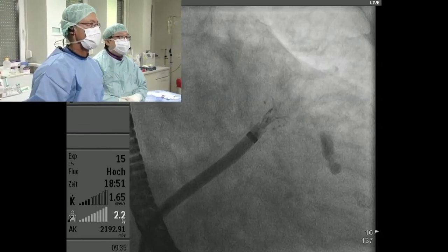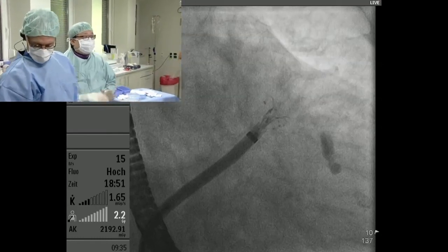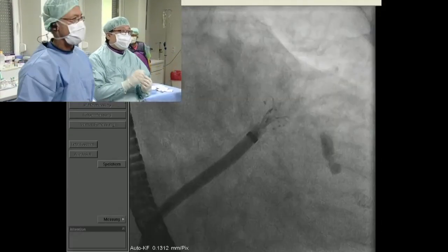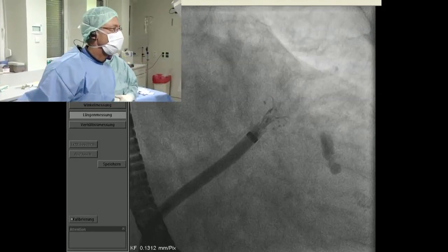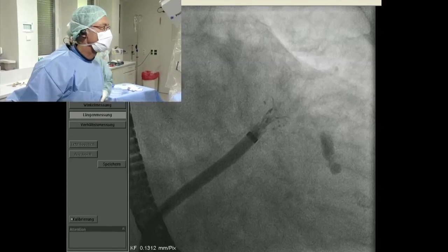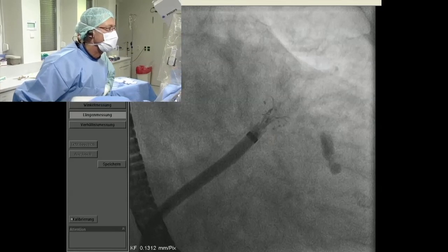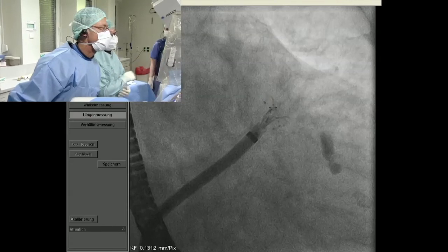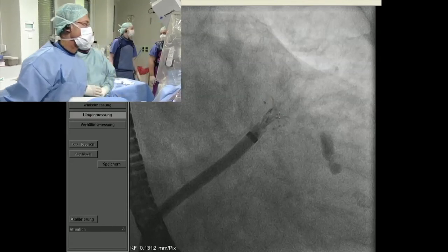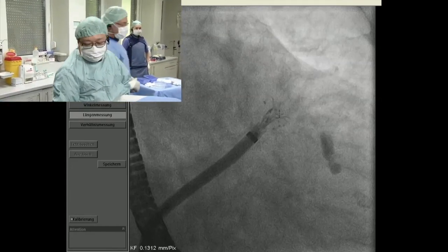I think that's very important, because if the umbrella is not opened properly, the distal end is not really atraumatic, because the metal frames of individual struts may touch against the appendage wall. I don't know whether you can see this cursor. Yeah, we can. So I think this strut here is looking good, right? But the others are not in the same line, so some of them are distorted. Would you like to point it out? Okay, let me try to use this. It's a very small joystick.